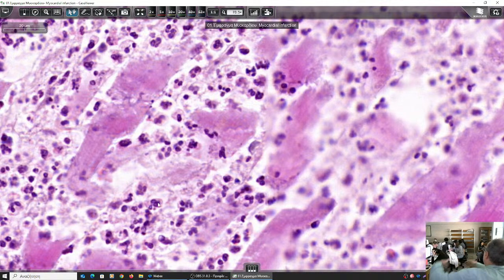So what do I say? I'll give you the myocardial infarction slide, and I'll tell you, show me the neutrophils. That's all. By the way, you have all the slides at your disposition from the documents. If you open the documents in your e-class in the portfolio, you'll find all the links for all laboratory exercises of Pathology 1. So, is that clear? So what do we see here? We see non-viable, necrotic, fragmented myocardial fibers and the accumulation of cells of acute inflammation, neutrophils.